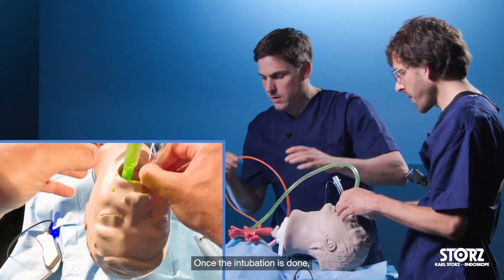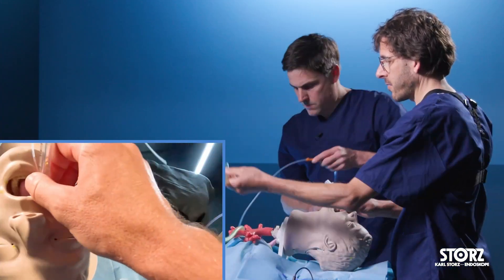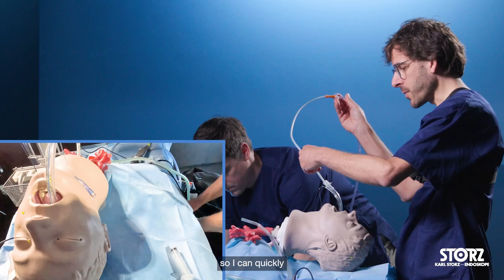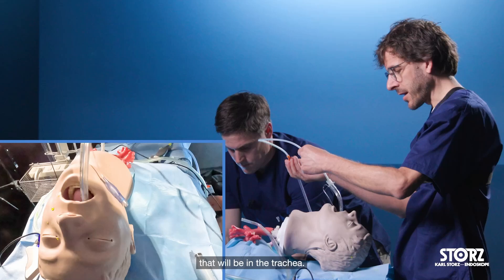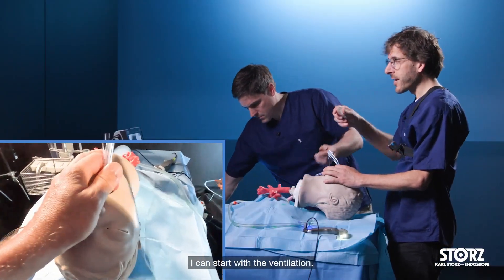Once the intubation is done, it is important that I have a flexible suction catheter ready to go, so I can quickly and without interruption go into the trachea to clean out everything that will be in the trachea. Once that is done, I can start with the ventilation.